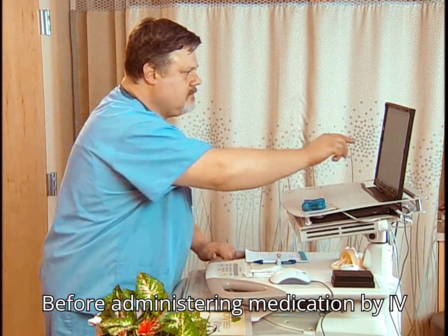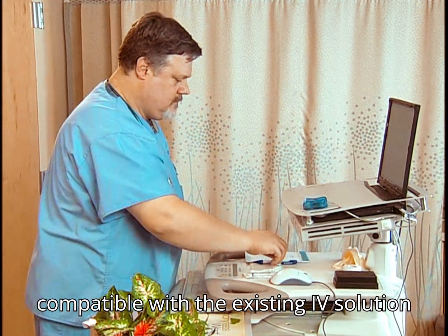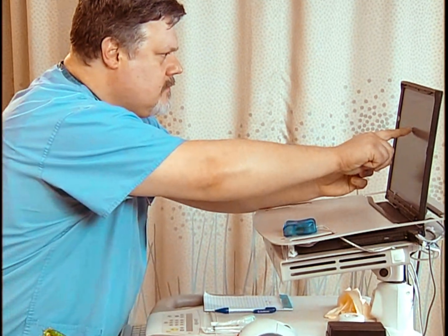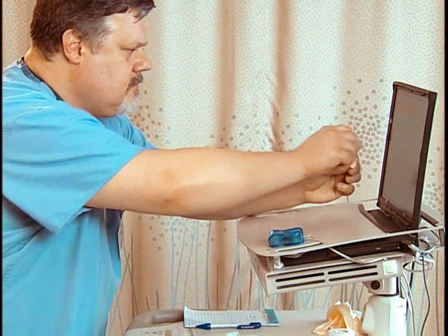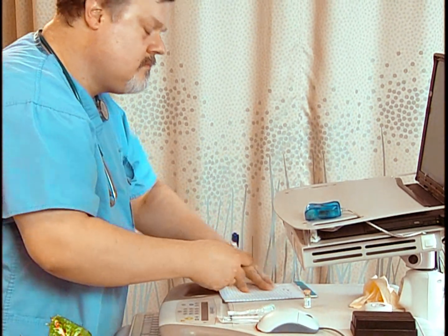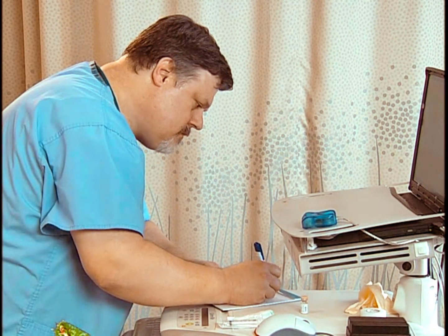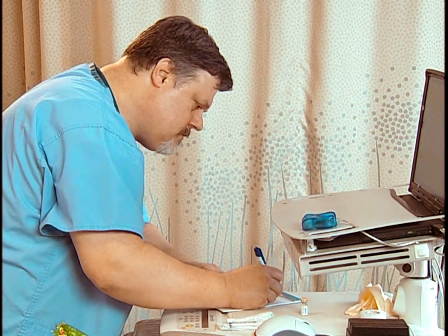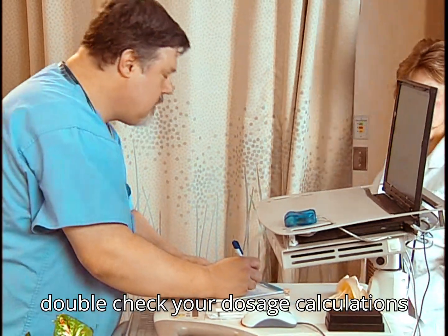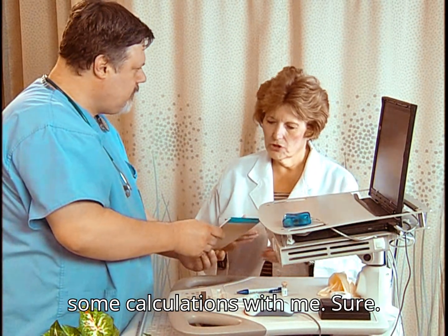Before administering medication by IV bolus, ensure that the drug is compatible with the existing IV solution and any additives in it. If required by facility policy, double check your dosage calculations with another nurse.